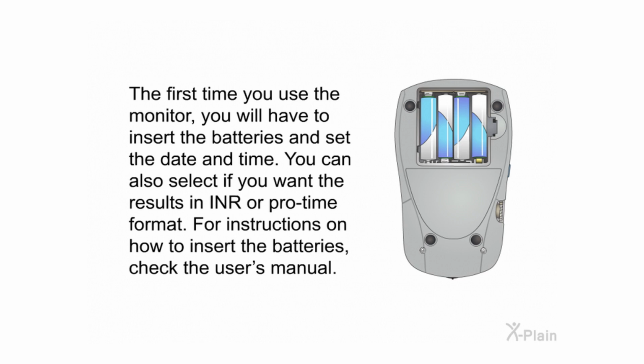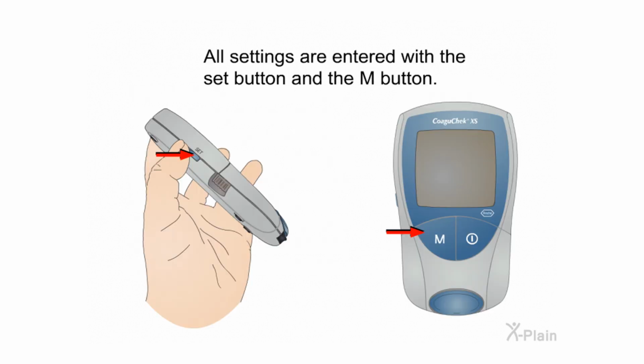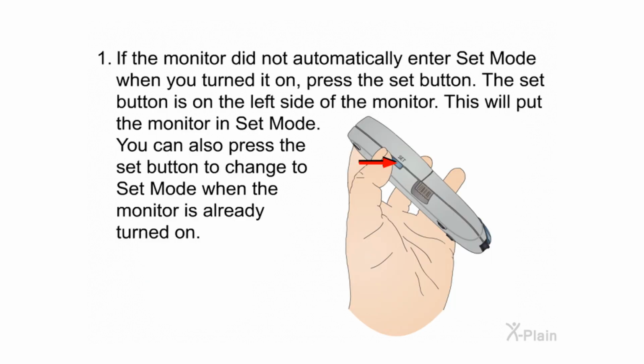Setting up the meter. The first time you use the monitor, you will have to insert the batteries and set the date and time. You can also select if you want the results in INR or ProTime format. For instructions on how to insert the batteries, check the user's manual. All settings are entered with the Set button and the M button. 1. If the monitor did not automatically enter set mode when you turned it on, press the Set button. The Set button is on the left side of the monitor. This will put the monitor in set mode. You can also press the Set button to change to set mode when the monitor is already turned on.